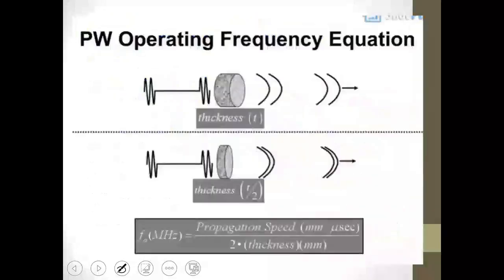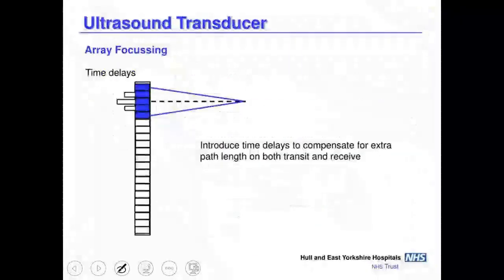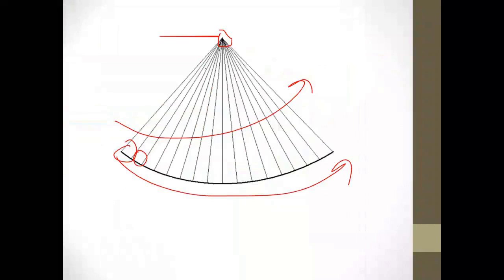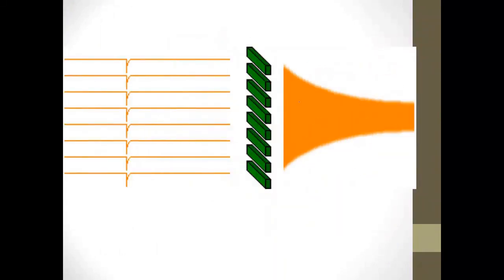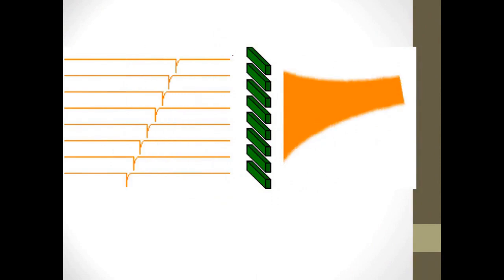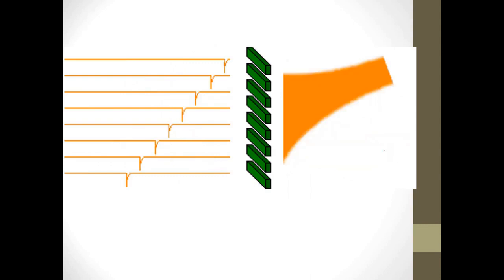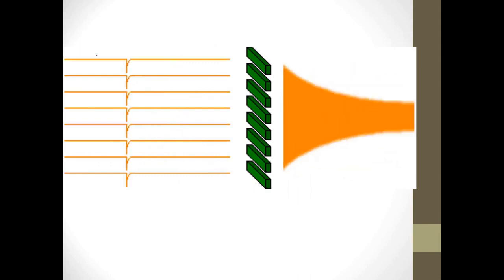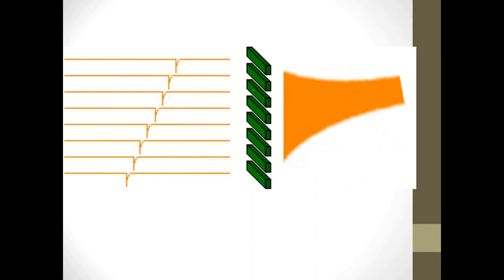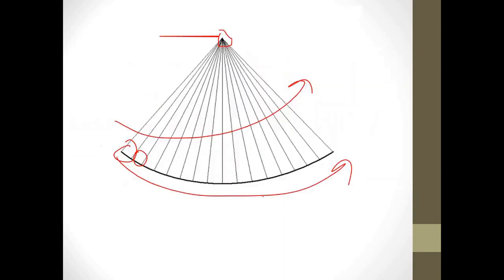We talked about the ultrasound transducer and the focusing that occurs with different signals. This is the same information. It seems like it is changing the timing between the elements and the signals. As you change your focal angle or your focal points, it alters the timing of the electrical signal that activates the existing elements. The shape of the beam that comes out has resolution aspects.